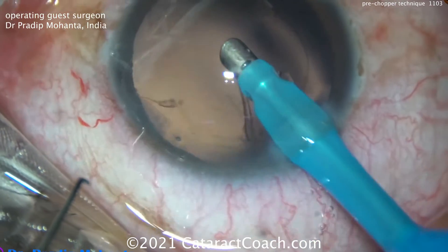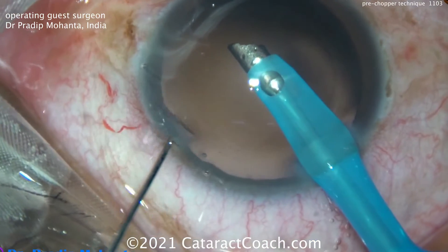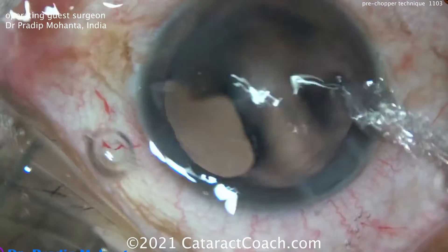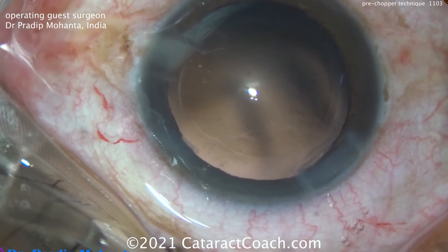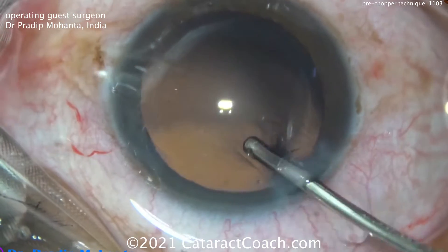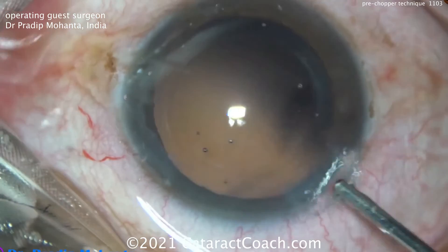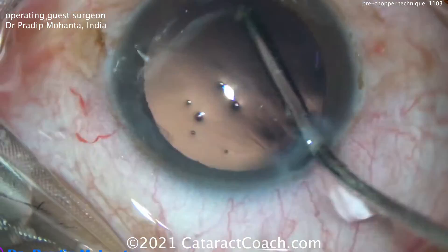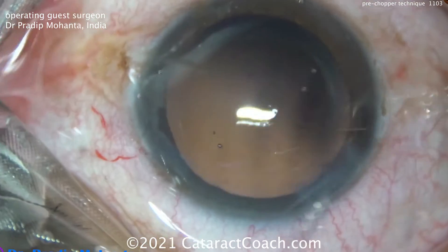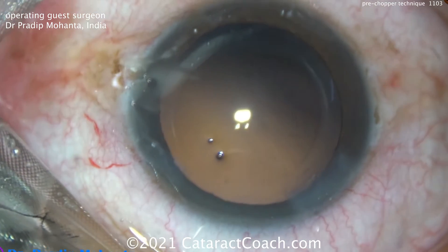Now you see Dr. Mohanta removing the cortex using the FACO probe. That's an expert level — I don't recommend that for most surgeons. He has to be very skilled in order not to break the capsular bag. But he removed all the cortex with simply the FACO probe. He's going in and out with another cannula just to irrigate — to power wash the capsular bag — make sure it's nice and clean. And we'll put the lens in.